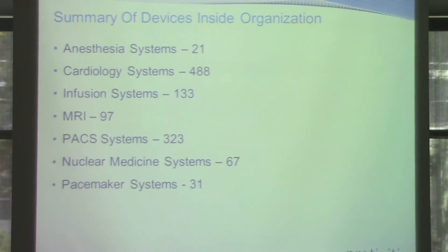PACS? So PACS, it's a PACS system. That wouldn't be a patient safety issue. That would be more patient privacy. PACS systems are where all of your radiology equipment images that you see inside healthcare facilities, your MRIs, your CTs, your nuke imaging, are stored, in the back end PACS system. So there's a treasure trove of patient information there.